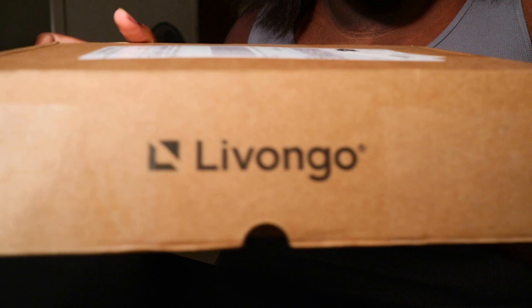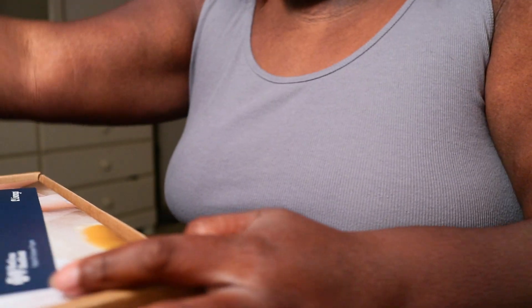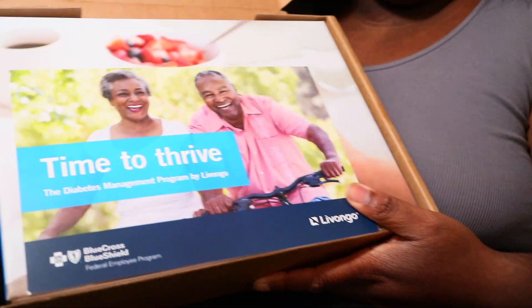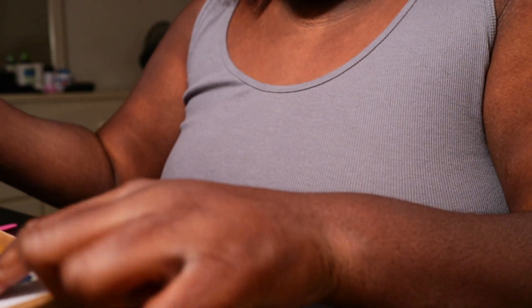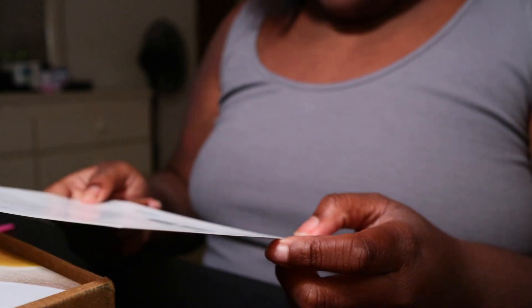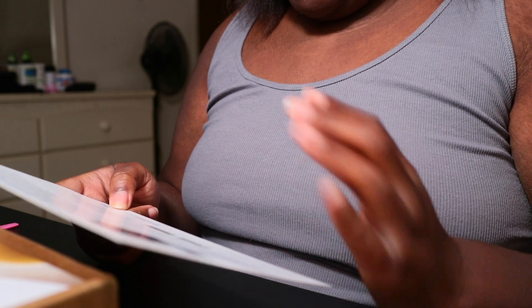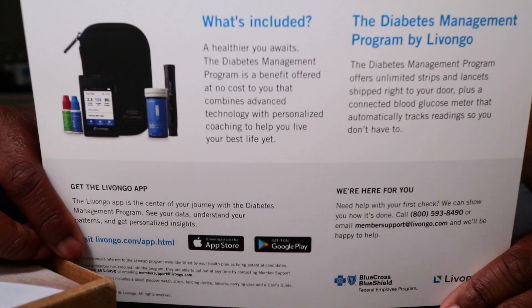This is the name of the company, and this is what the box looks like. It's got an app — I've already downloaded the app — and I think this is with the insurance provider Blue Cross Blue Shield, which is what I got. You guys can pause the video and read that.